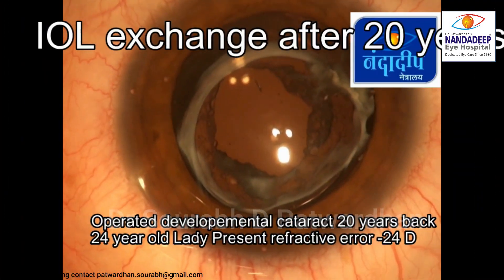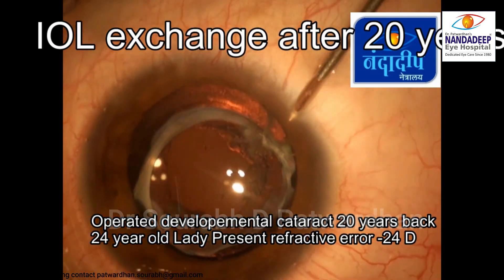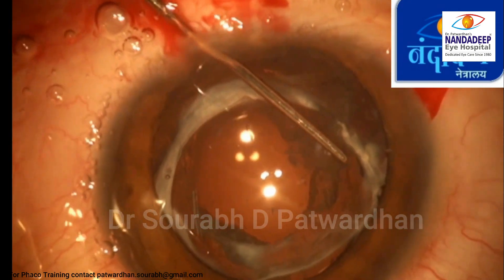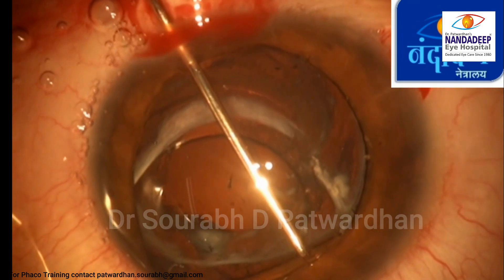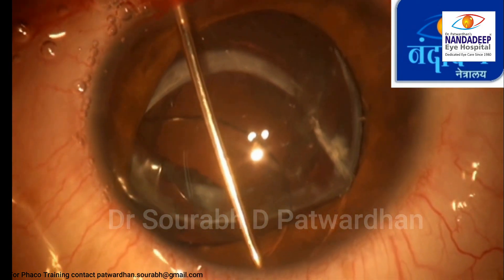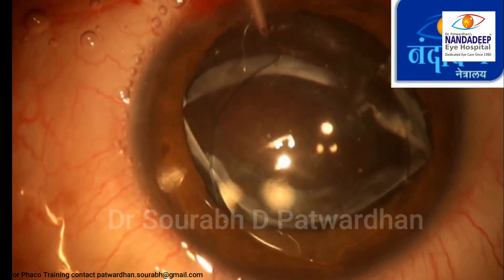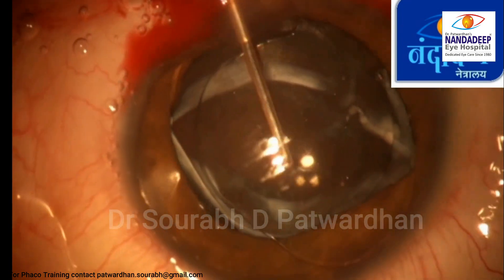This is an interesting case where IOL exchange is being done almost after 20 years. This patient had undergone developmental cataract surgery 20 years back and developed minus 24 diopters of refractive error. The PMMA IOL in the bag is difficult to remove, but with patience you can maneuver it out — being careful to avoid any capsular bag damage.